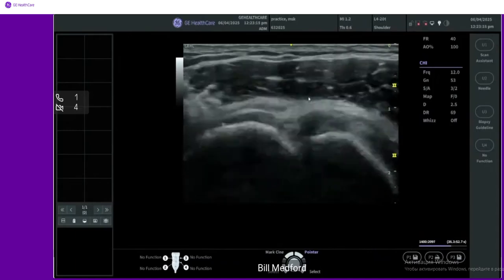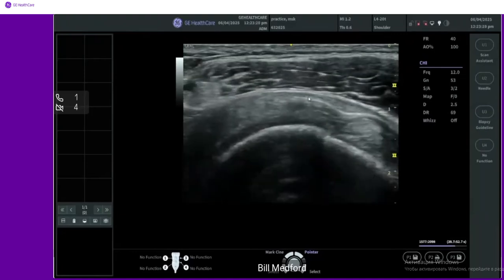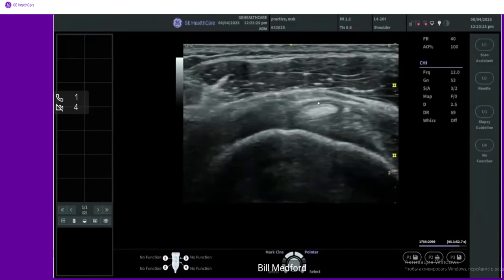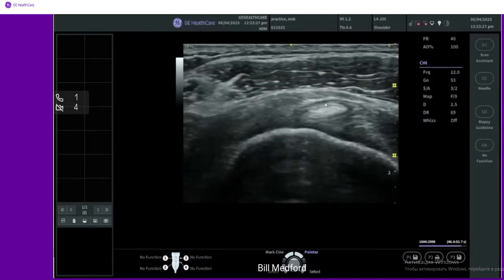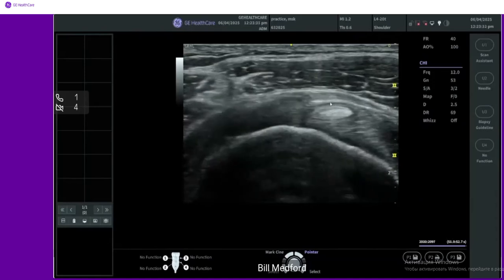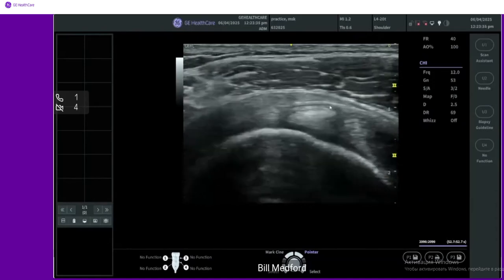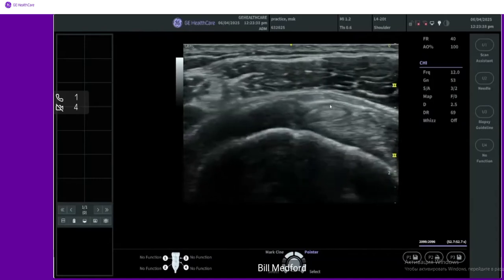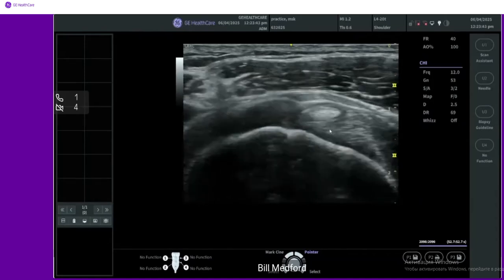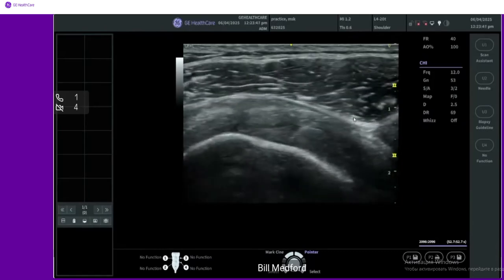This is actually the bursa here. If we rotate, you see how that all slides. But you see this one ligament coming over the top of the bicep right here, that's the coracohumeral ligament, and that's the location where you might recognize some thickening and consider measurement. The superior glenohumeral ligament, conversely, comes back here behind the long head of the bicep.